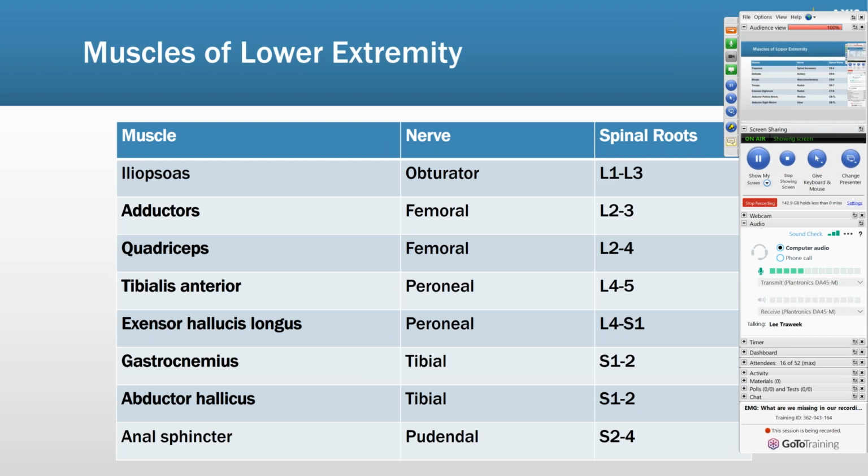For lower extremity, many times techs are monitoring the iliopsoas muscle, but the iliopsoas is a muscle which is inside the iliac bone and it's very, very deep. So if you're putting any 20 millimeter long needle, you cannot reach the iliopsoas muscle. You have to use a longer 37 or 50 millimeter long needle.